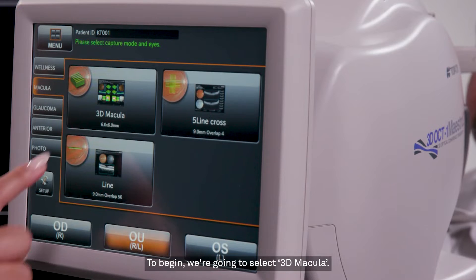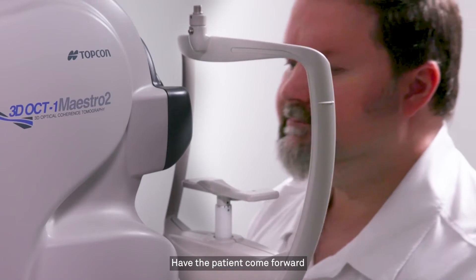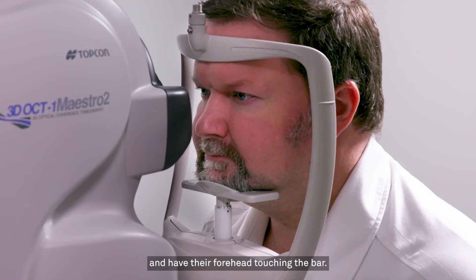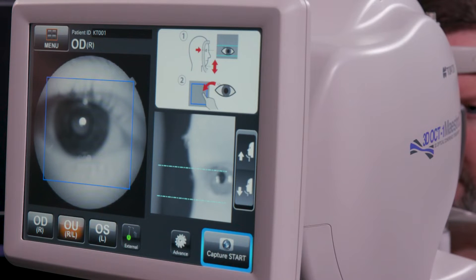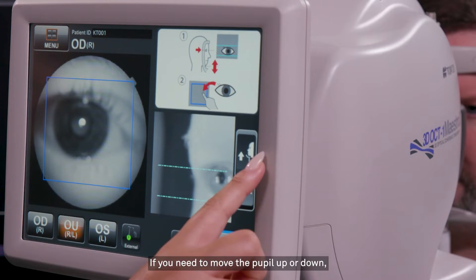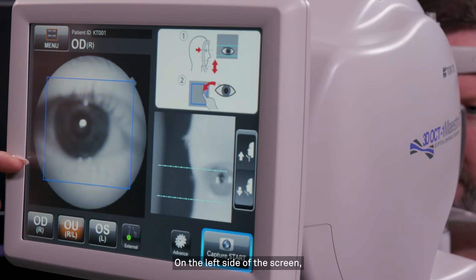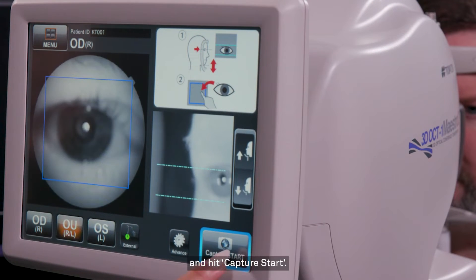To begin, we're going to select 3D macula. Have the patient come forward and place their chin on the chin rest and have their forehead touching the bar. Make sure the pupil is in between the dotted blue lines. If you need to move the pupil up or down, you can adjust the chin rest height with these arrows. On the left side of the screen, to better center the pupil within the big blue box, tap the center of the pupil and hit Capture Start.